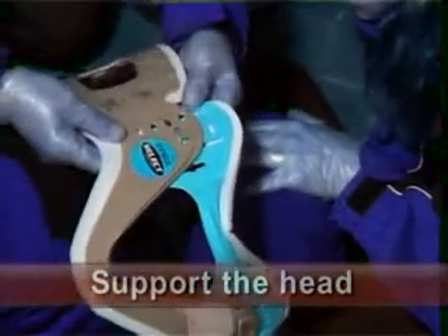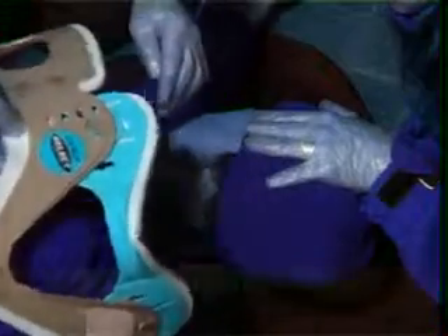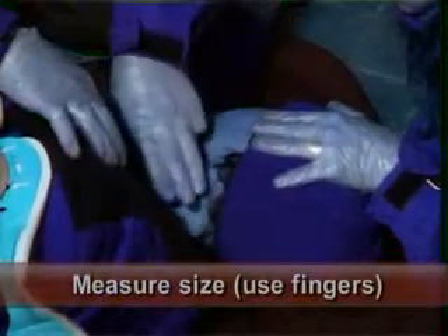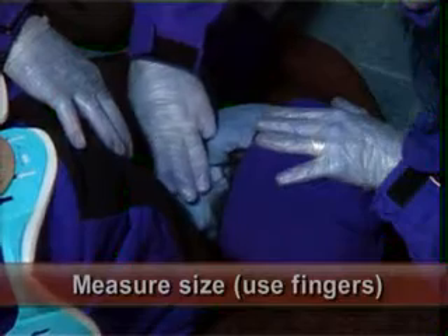We're going to fit an adjustable stiff neck collar under the patient, which needs to be measured. We need to measure from the shoulder to the bottom of the mandible. On this patient it's three fingers long, so we'll measure three fingers.